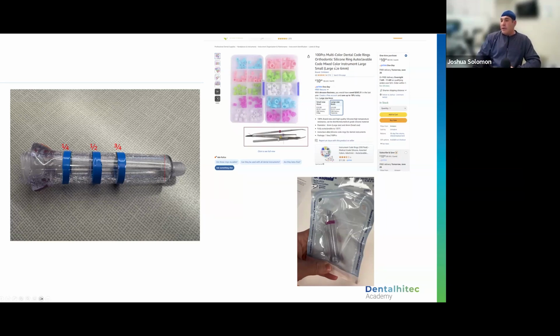Dr. Miranda had posted this online: how do you tell the difference between the cartridge for the Sleeper One or the SOAN? You can buy these at Amazon, very inexpensive. They're just little autoclavable instrument rings, and you can label colors, one for SOAN, one for Sleeper One.